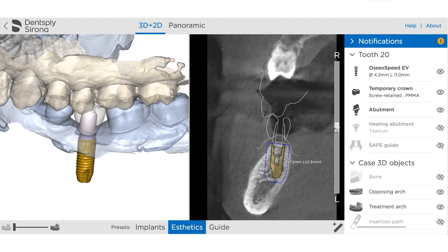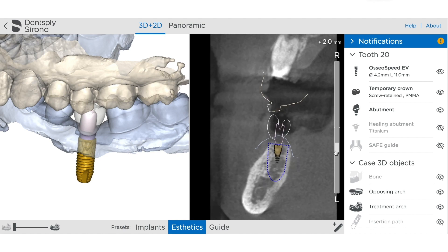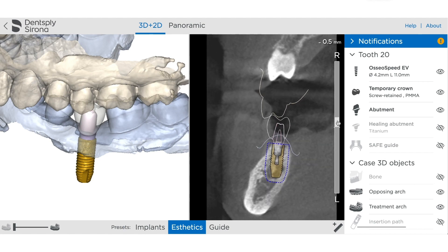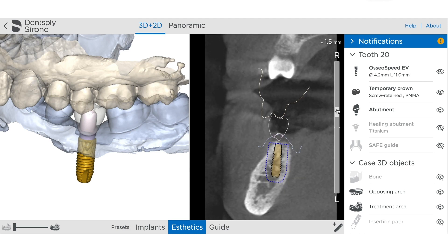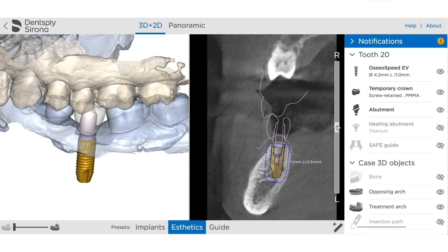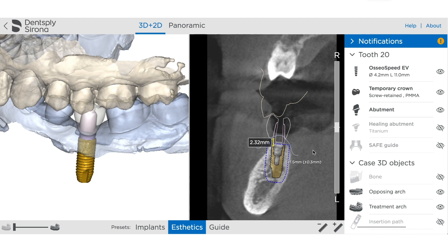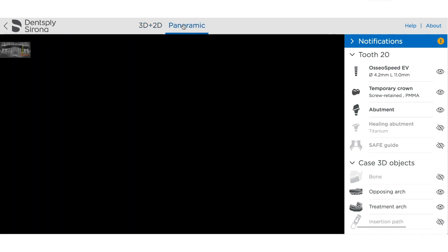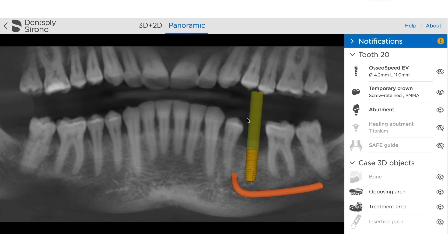We're also going to be able to scroll through the implant and bone to make sure that in all positions and all CT slices our implant is positioned appropriately. In the 2D window we can click on a ruler setting that allows us to take any measurements we like — maybe the platform of the implant up to the restorative margin, or the implant to the adjacent CEJ — and easily take a quick measurement.